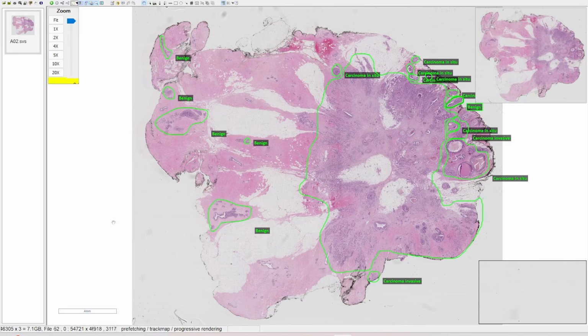So in this lecture, we have dealt with the ImageScope application, learned how to download it, make different annotations, create different layers, and annotate different regions to specific layers. And then we handled the annotations menu, how to add descriptions and text to it, and then how to analyze the different regions and manipulate the different options. And finally, we have learned how to open annotated whole slide images that we have previously annotated or that have predefined annotations by other people.